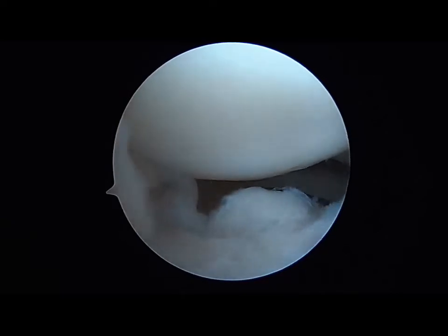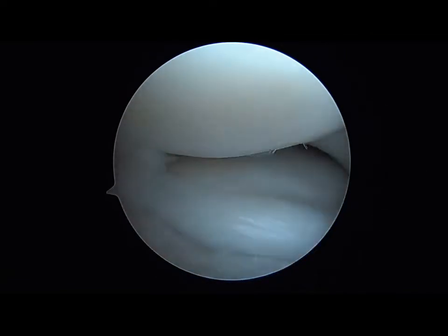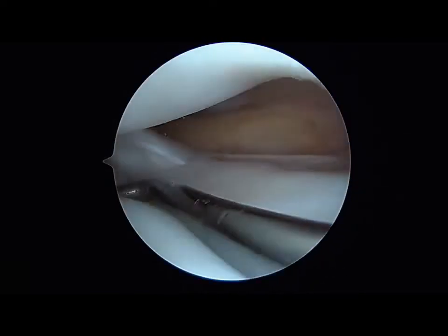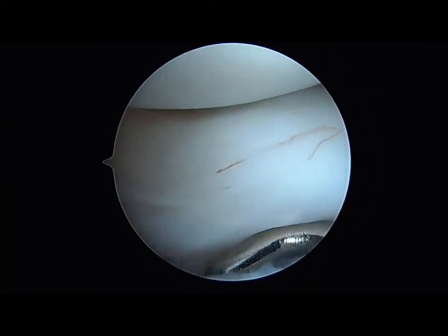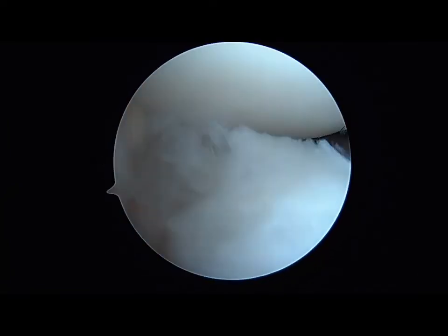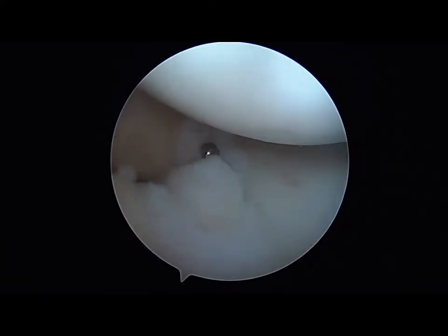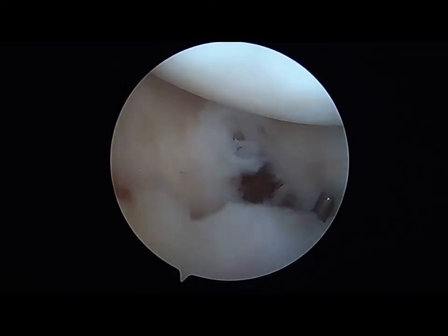Probing of the meniscus is performed at the anterior meniscocapsular junction to assess stability, as well as the posterior margin of the meniscus to assess the attachment around the popliteus, and finally, lateral attachments of the meniscus are assessed. The arthroscope is then inserted into the anteromedial portal, and direct visualization of the anterior meniscocapsular junction is made, and stability is further assessed.